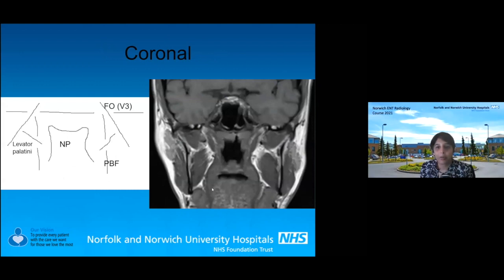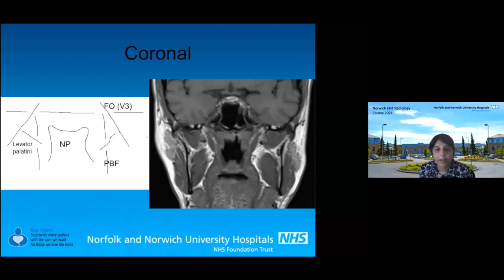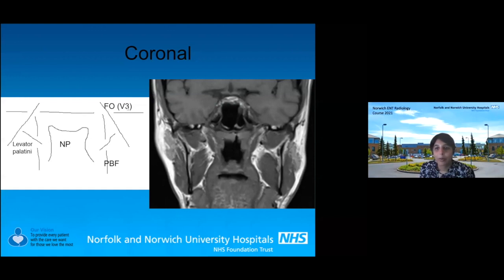On the coronal image and diagram, this is the nasopharynx, and you've got the pharyngobasilar fascia, which is tightly applied to the nasopharynx. This is the levator palatini muscle. You can see that if a tumor comes out through the pharyngobasilar fascia, that is a weak point — it will climb out, and before you know it you're on the trigeminal nerve, heading up to the skull base with perineural spread. That would make it inoperable.